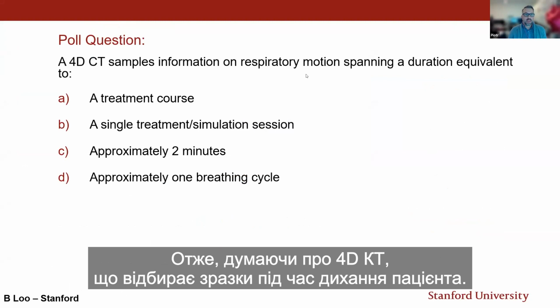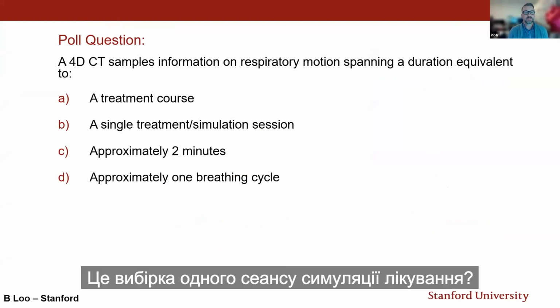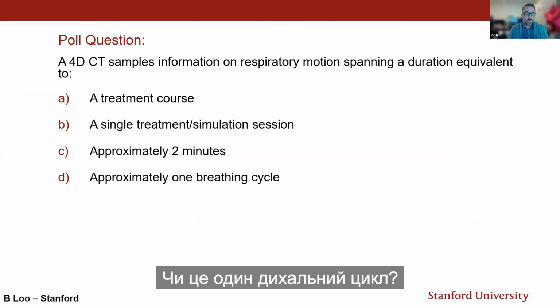So thinking about what a 4D CT samples during the patient's respiratory duration, what is the 4D sampling? Is it the entire treatment course? Is it sampling a single treatment simulation session? Is it sampling about 2 minutes of a patient's breathing? Or is it one breathing cycle?